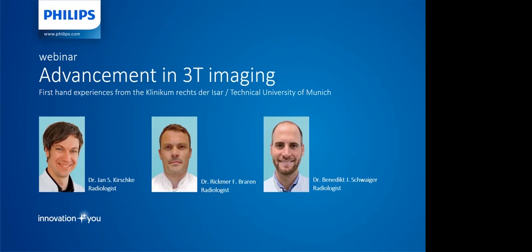One major advantage at the spine, in particular at the lumbar spine, is that if you switch to 3D imaging with a slightly sub 1 millimeter isotropic spatial resolution, there's been one study from Cologne that showed that you won't miss a relevant clinical finding by using such a sequence that just takes 5 minutes and basically covers all the planes and all the possible reformations. So we haven't investigated 3D imaging in the spine a lot, but there's one good paper out that showed its feasibility, and you basically can cut down your exam time for a lumbar scan to 5 minutes using one 3D sequence with Compressed Sense.